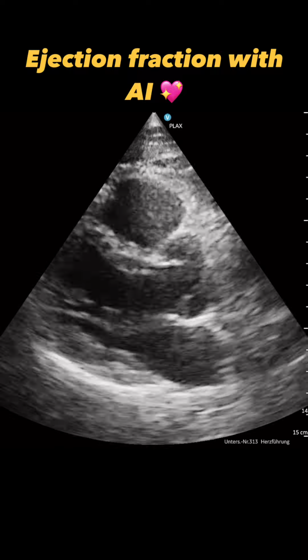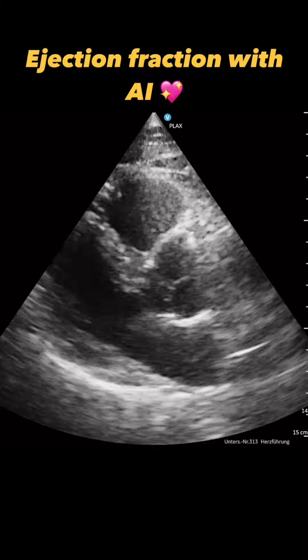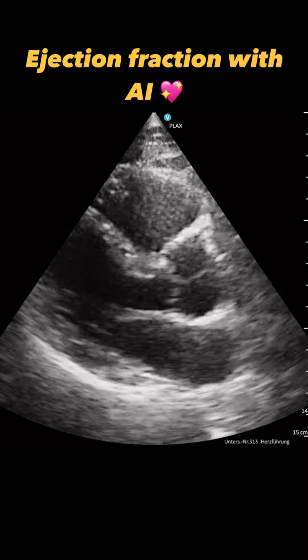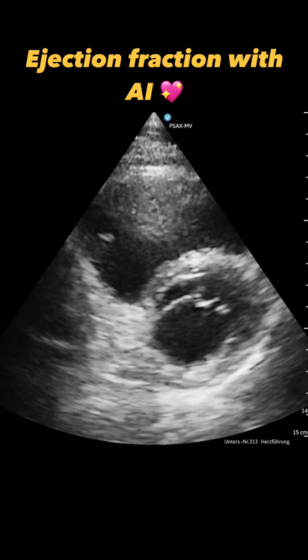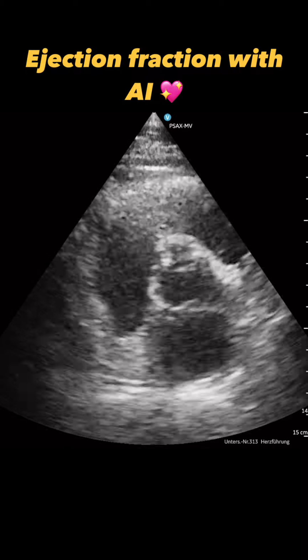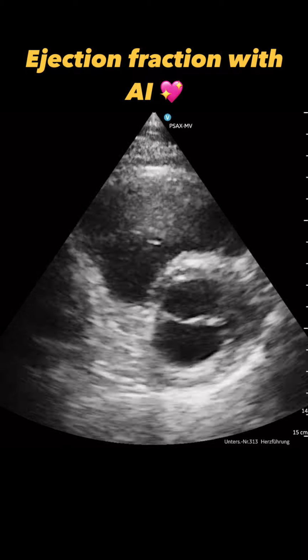Coming back to the ejection fraction measurement with the help of this AI tool. Well, for this specific Caption AI tool, you need a parasternal long axis. You are also introduced to a parasternal short axis view. Actually, this view was deemed appropriate by the AI, so you still have to judge with your own eye how valid the exam and the loops, the views are.